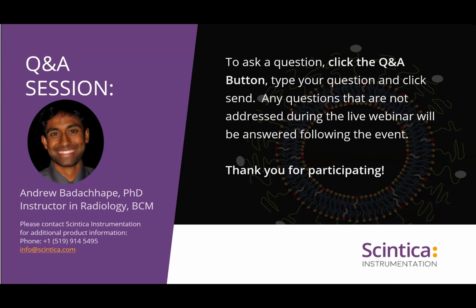Andrew, Charmaine has asked another very interesting question, and she's asked, since the agent extravasates into tumor tissue periphery, can the gadolinium agent potentially load drugs for therapeutics? That is a very interesting question. One thing that we always have to be worried about with coupling additional molecules or chelating additional therapies is clearance mechanisms, the size, and where it's going to actually be able to get into. One thing that we do often do in applications with this that our lab has published on is we've added targeting ligands to these liposomal agents for looking at biomarkers or other features of interest.